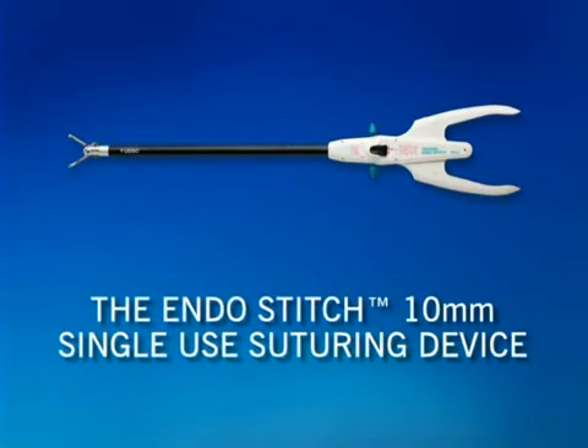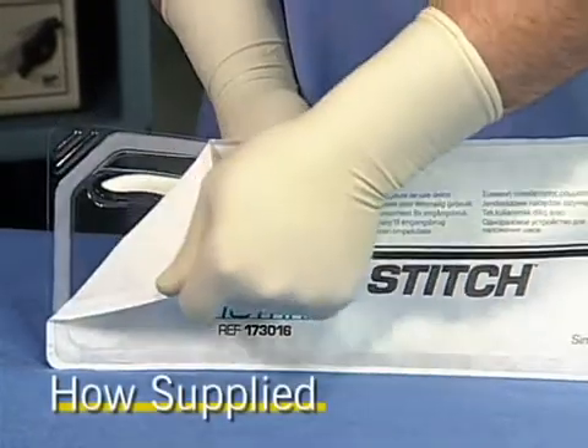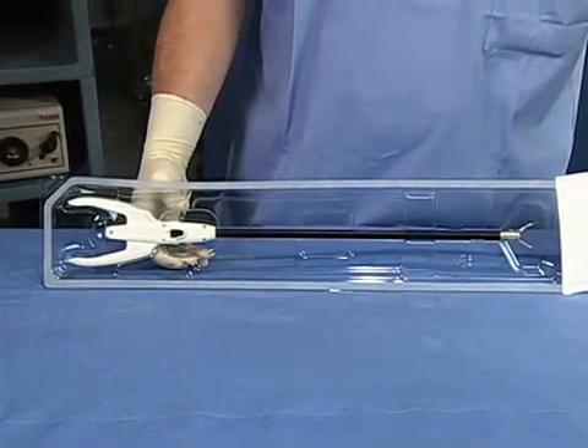This in-service video provides basic instructions on using the EndoStitch 10mm single-use suturing device from AutoSuture. Please refer to the instructions for use packaged with the product for more information. The EndoStitch single-use suturing device is shipped sterile. Cartridge reloads or SULUs are also shipped sterile and supplied separately.